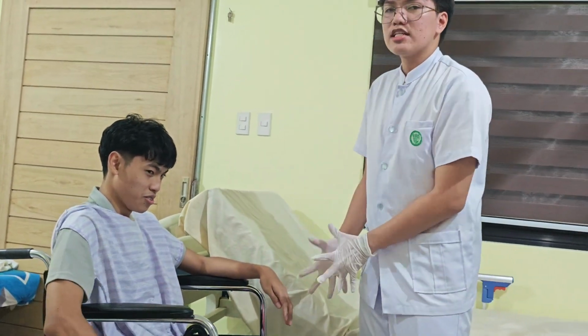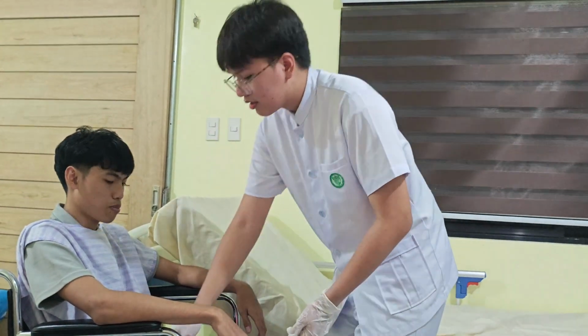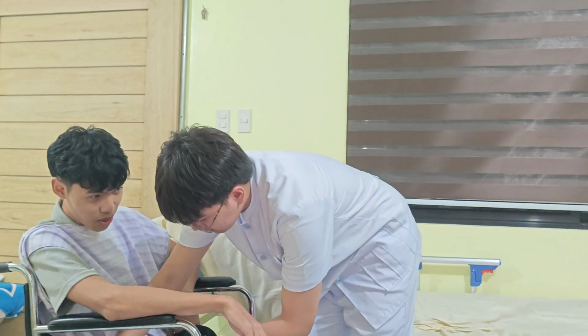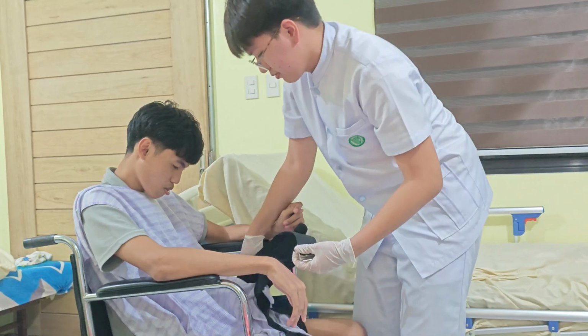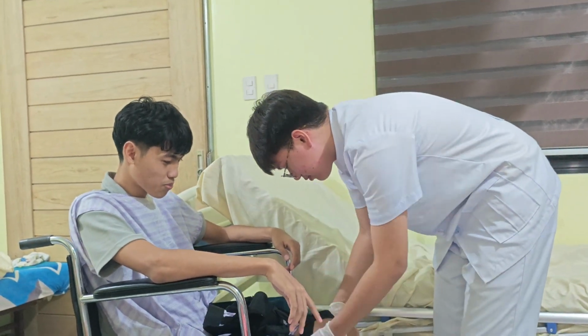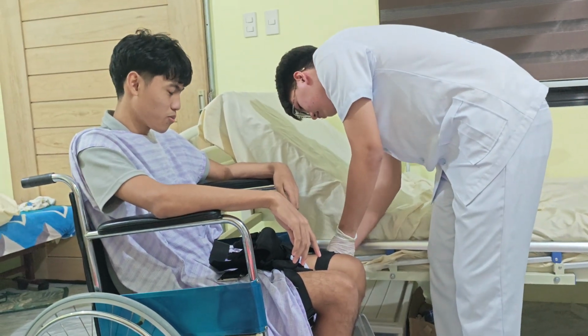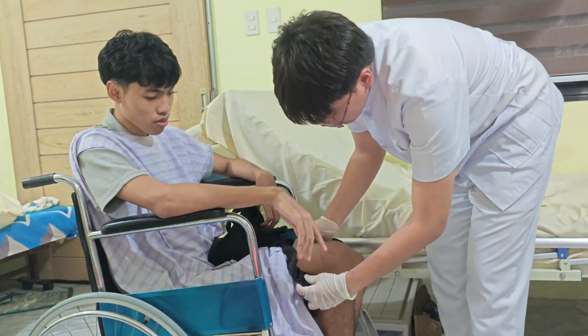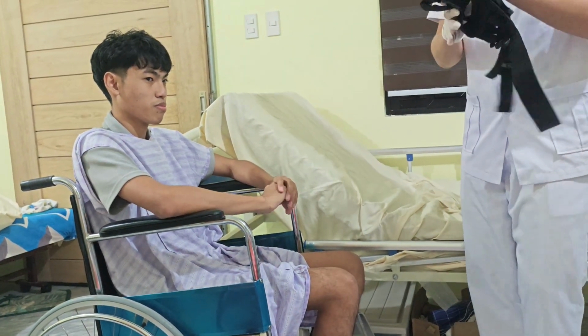And then, I'm going to assess whether the patient is in the center of the chair and remove their gait belt. After that, I'm going to clean the transfer aids. After cleaning the transfer aids, I'm going to remove my gloves and perform hand hygiene. And that's all.